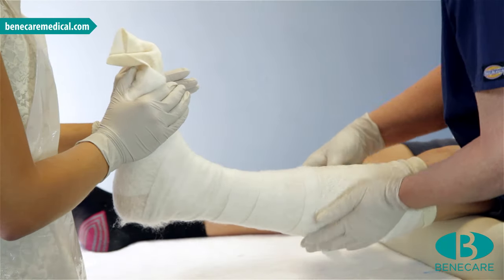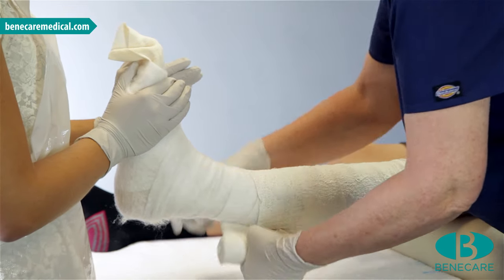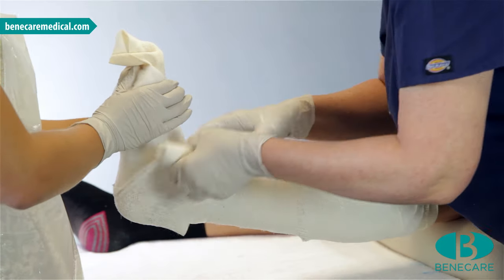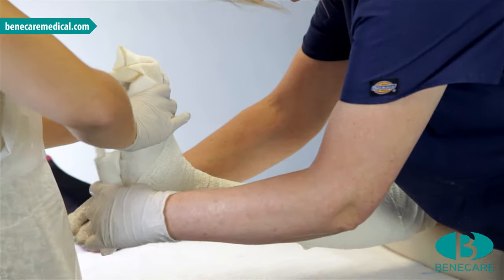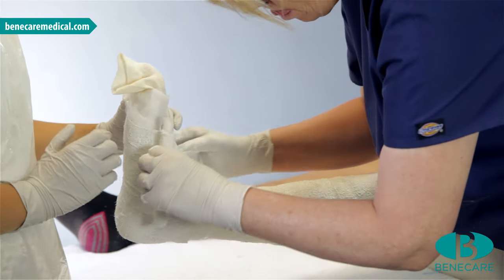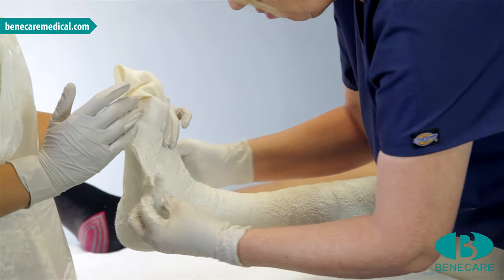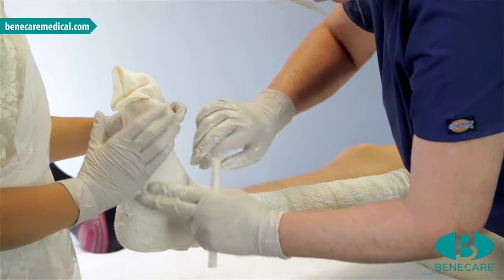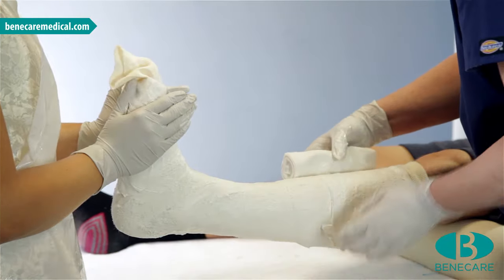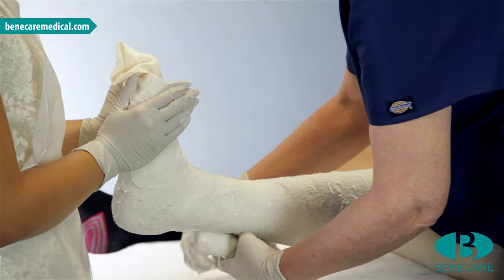Start to bandage at the knee around the distal aspect of the tibial tuberosity, covering 50% of the previous turn. Work the bandage down the leg; at the toes, continue with the bandage back up the limb, applying extra layers over the foot and ankle. Now take the second bandage and repeat as with the first. This will ensure even coverage throughout.